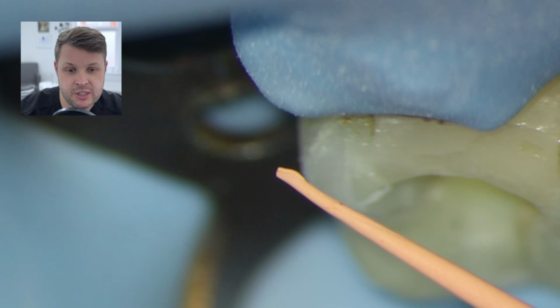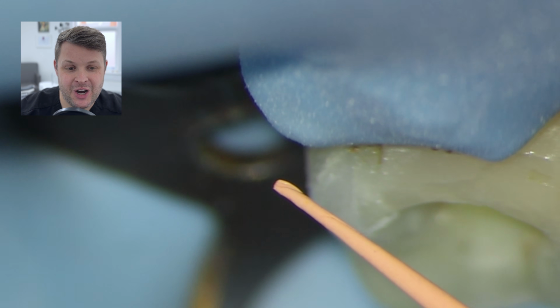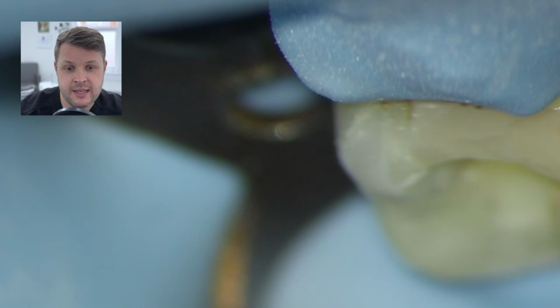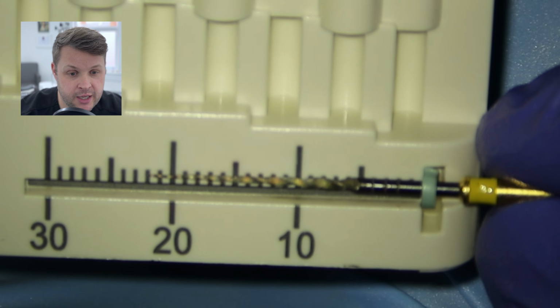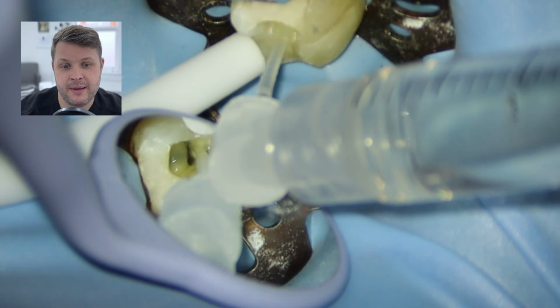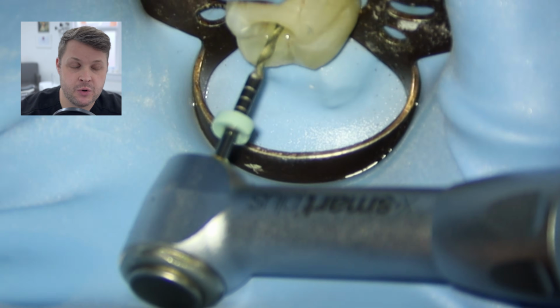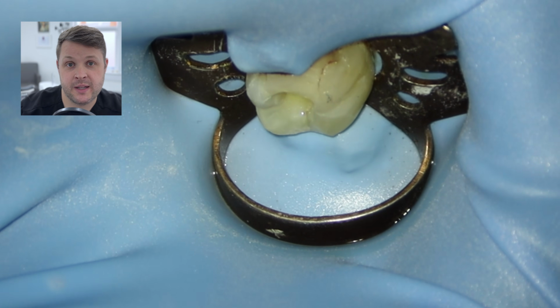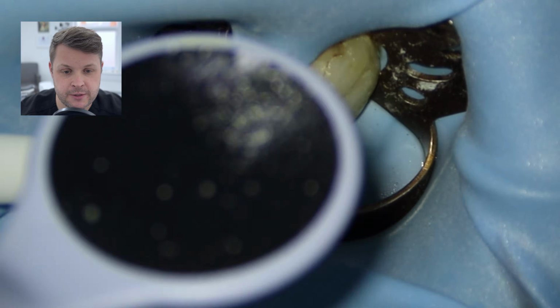And obviously what we do is we measure the rubber bung on the hand file to see where this is marked on the GP point, and then we're going to shape up to this point. What you don't want to do is use your rotary files and move around this tight bend at the joint, because the other part of the canal has been shaped successfully. So why make any more work for yourself, and it's safer as well. Make sure that you're only shaping up to the point where the two canals join.